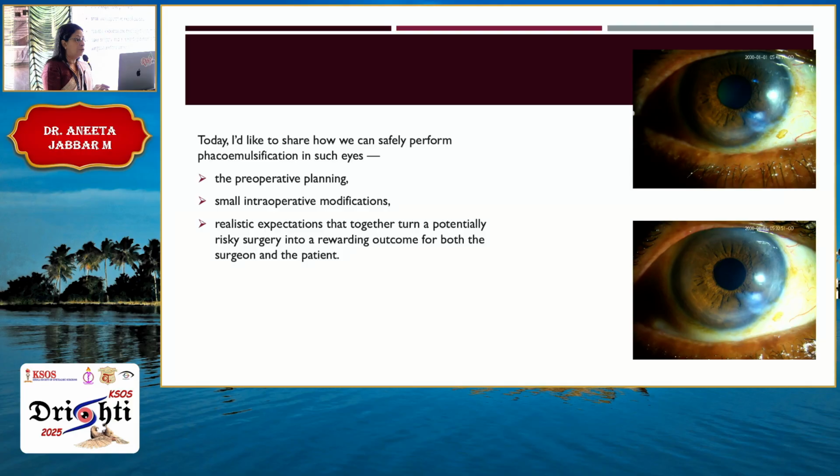So today I would like to share how we can safely perform phacoemulsification in such eyes. I'll be talking about the preoperative planning, small intraoperative modifications, and the realistic expectations you should give to the patient that can turn a potentially risky surgery into a rewarding outcome for both the surgeon and the patient.